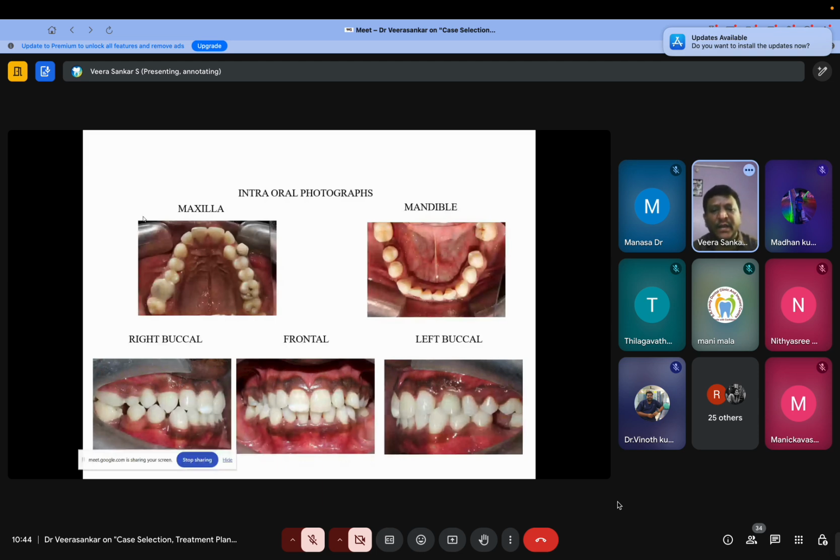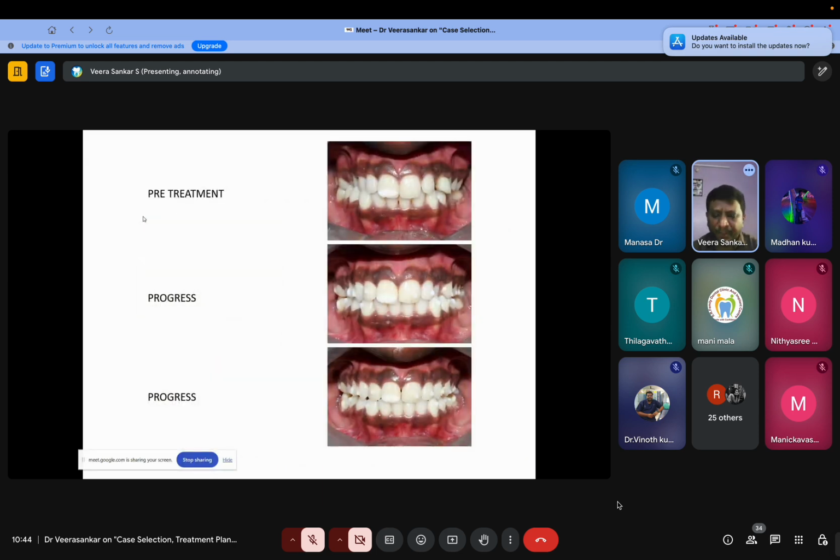Moving on with the clear aligners. This is after 5 months of treatment. We can appreciate the transverse correction over the images taken at 2-3 months intervals. This is after the 3 months. This is after the next 3 months. Okay? We were able to correct the crossbite.